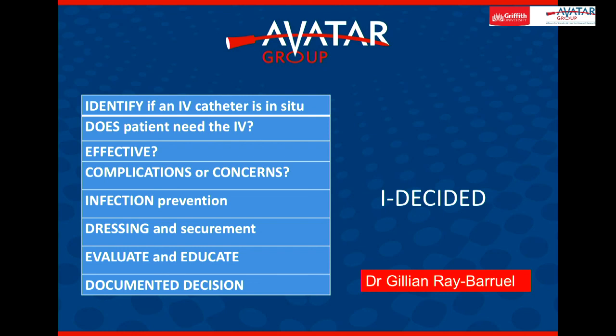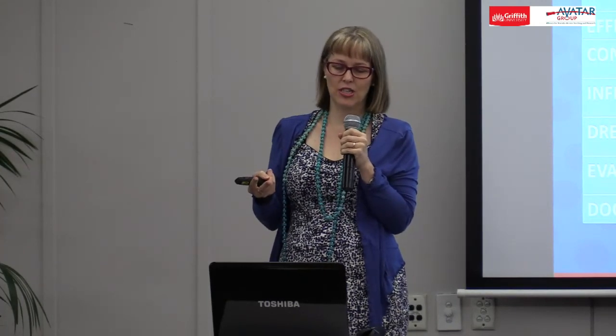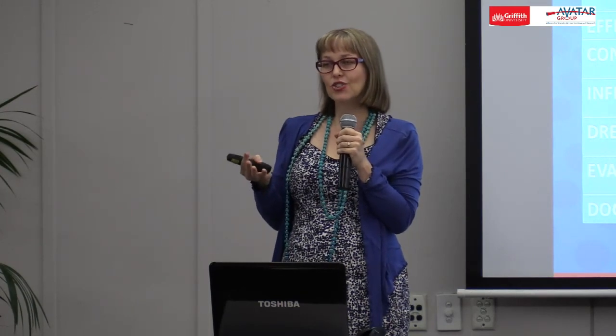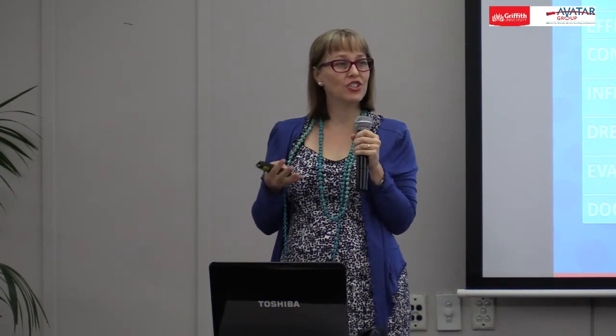And it's really going through the things we want to know, is, does it work? Like, is that catheter still working? Is it still needed? Can we get it out? Is there any hint of infection? Of course, take it out. Is the dressing and securement adequate? If not, fix it up. And of course, educating the patient.